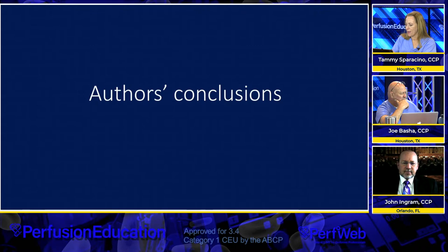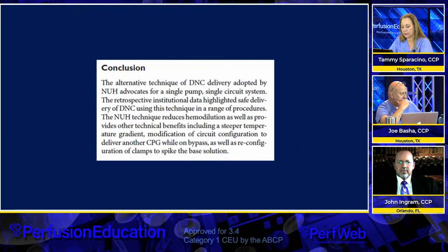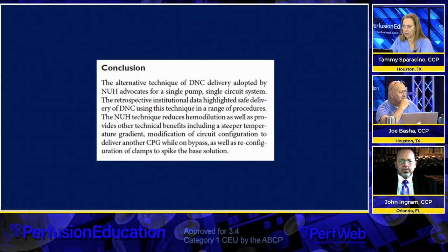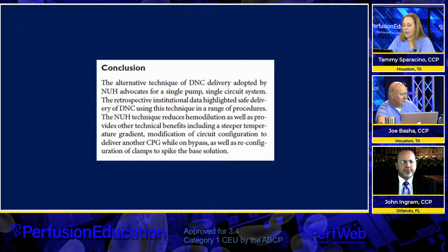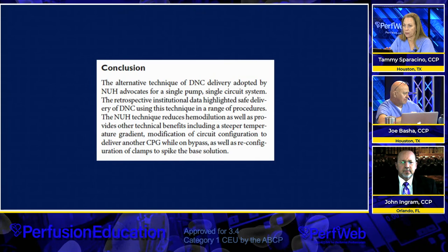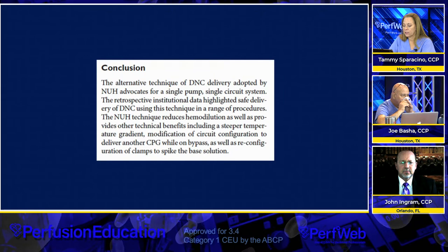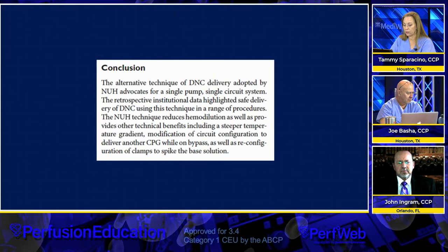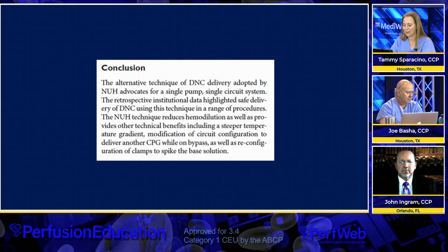Okay. So their conclusion for their study, which remember was just explaining the alternate technique they've adopted, is that a single pump, single circuit system just for cardioplegia that doesn't rely on the main circuit, they advocate for it. Their retrospective institutional data highlighted a safe delivery of del-Nido cardioplegia using their single pump system in a range of procedures. The NUH technique reduces hemodilution as well as provides other technical benefits, including a steeper temperature gradient, a modification of circuit configuration to deliver another cardioplegia while on bypass, as well as reconfiguration of clamps to spike the base solution.